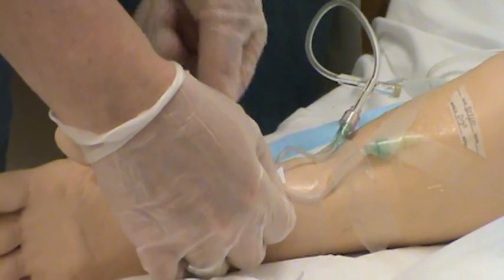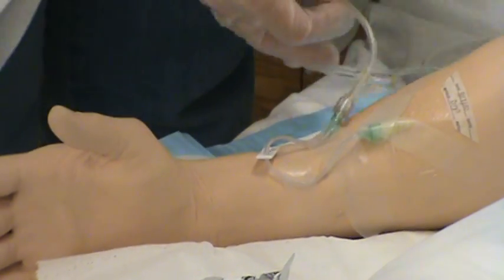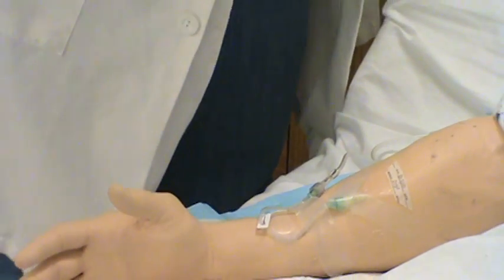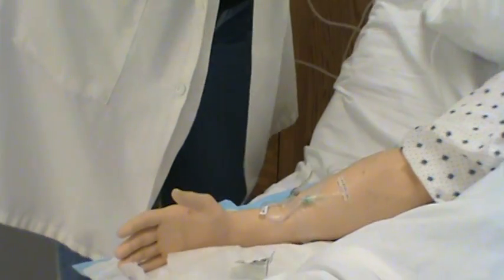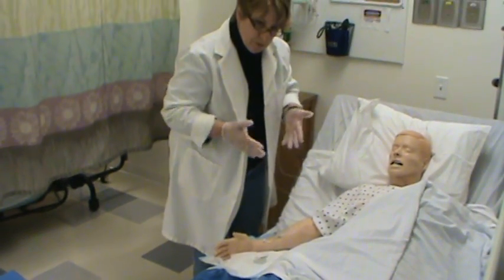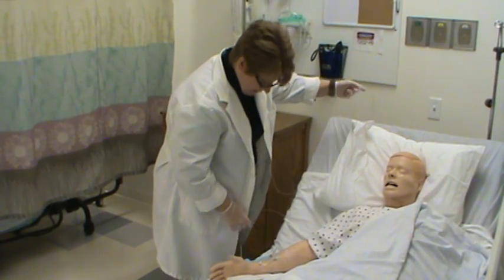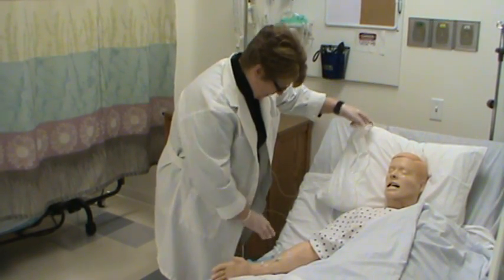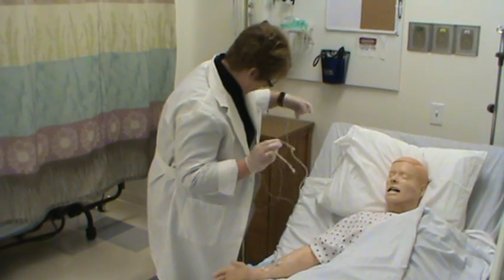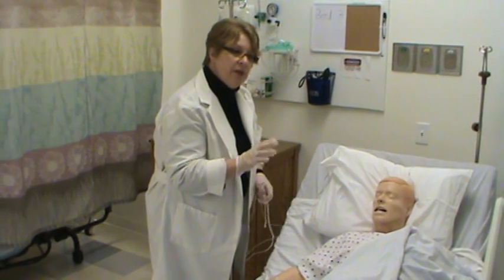Now what we need to do is to unclamp this. I don't want to block your view. We're going to unclamp that. One thing that I did not do that I recommend that you do is to have the bed at a comfortable working height. In the interest of time, I didn't. But you want to do that. Protect yourself. Okay, so I've got my new system hooked up. I've got my old system out of the way.